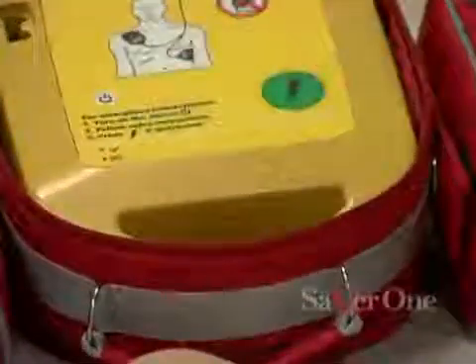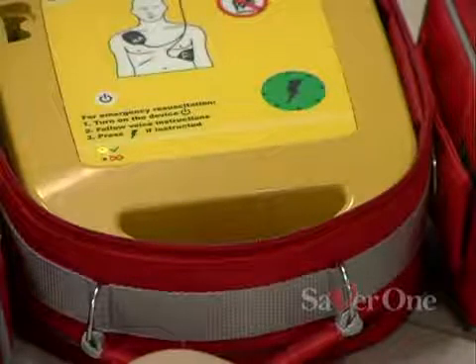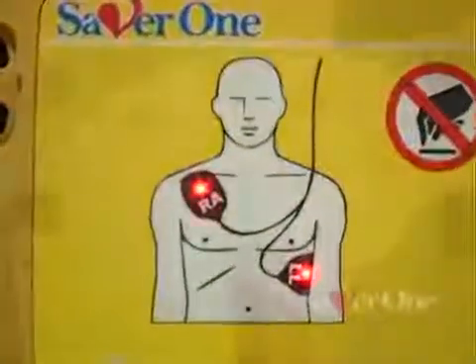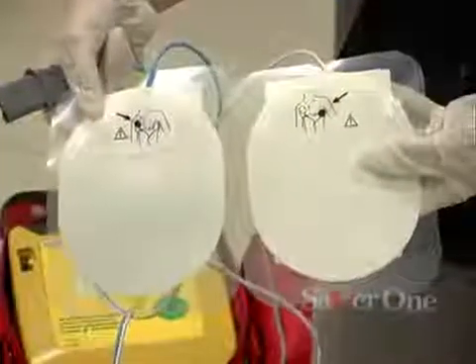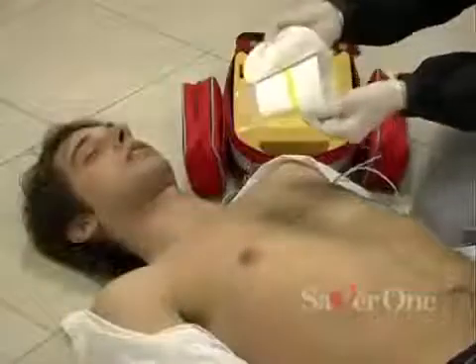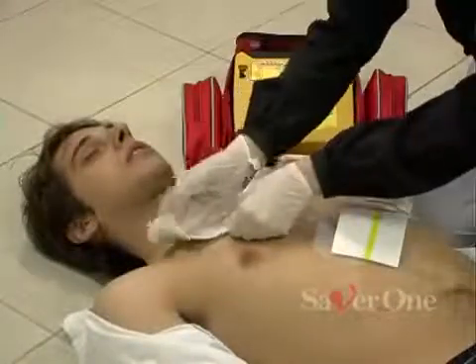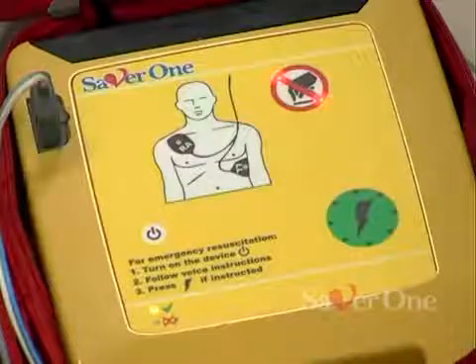Switch on the device — a light will confirm it's switched on. Follow voice instructions: place electrode pads. Place electrodes on the chest as shown on the pictures on the pads. Plug in the connectors. The defibrillator will now start working, informing the operator by voice messages.